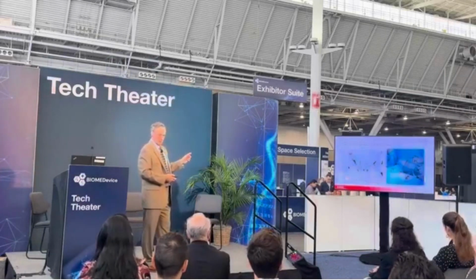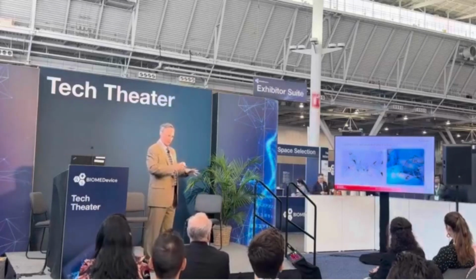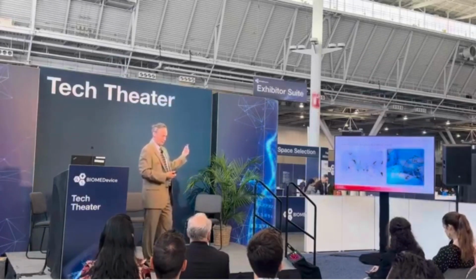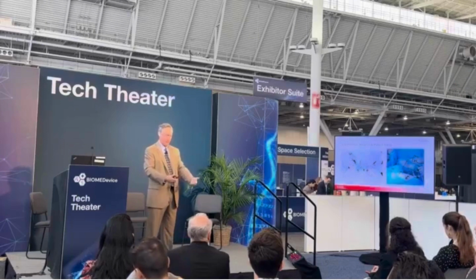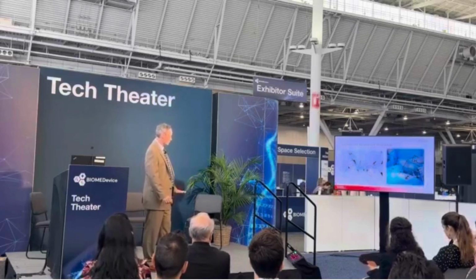I like the picture on the left because it shows 2 surgeons and 5 hands. That's a pretty accurate representation of what goes on. There's a lot of moving parts to these procedures. It's very complex. You've got someone holding the scope. You might have someone holding the grasper, and the surgeon's doing something else to triangulate to a particular anatomy inside the abdomen. And on the right is a fairly standard setup with 4 cannulas with the scope, and the insufflation is one of those tubes.